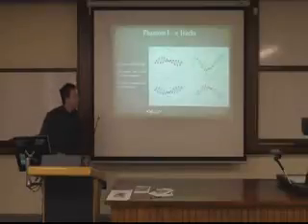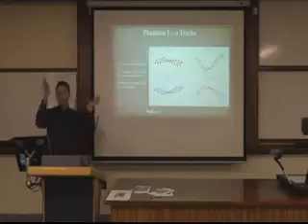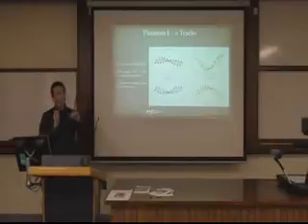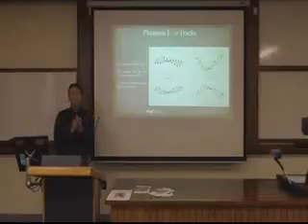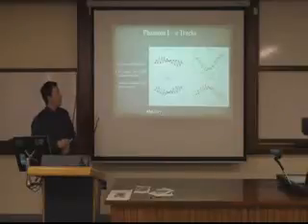And so, if you recall, with the LINAC, there's that orthogonal setup, and the way that it is, we couldn't have access to the kilovolt imaging system. So, with the phantom that wasn't moving, there's a pseudo-synchronicity between the images. Because it's invariant with time, you can therefore use images that are 90 degrees apart, and they still relate for stereoscopic reconstruction.